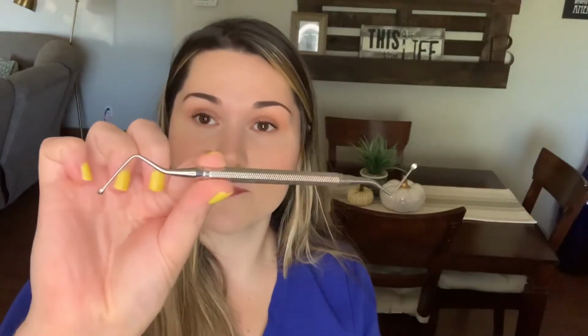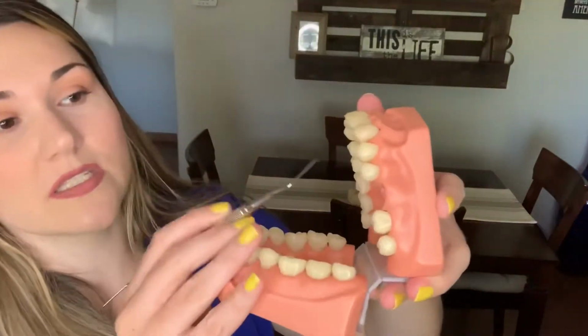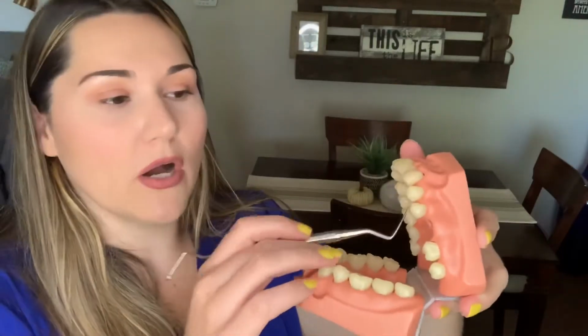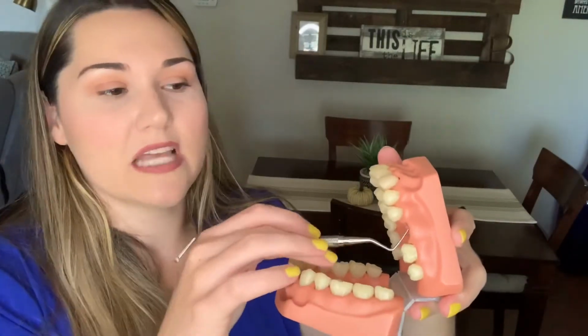And then the next step that my dentist does is he will ask me for this. Now, I don't remember the name of this. If you remember the name of it, please leave it down in the comments below. I don't. It looks like a giant extraction spoon. It looks like a spoon to me. But he will use this. He puts it into the socket. And just to make sure there's no leftover bones, there's no root in there, he just cleans out the socket so it heals better.